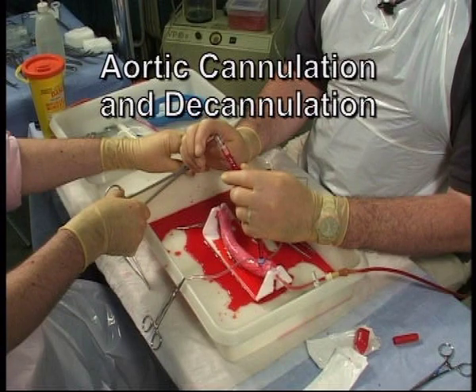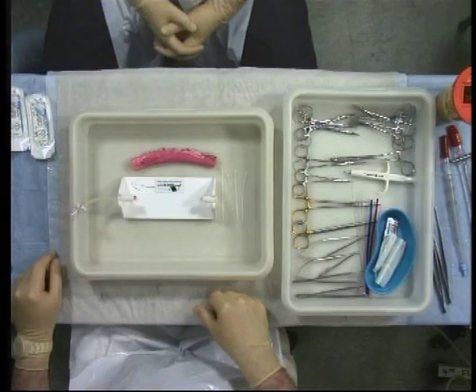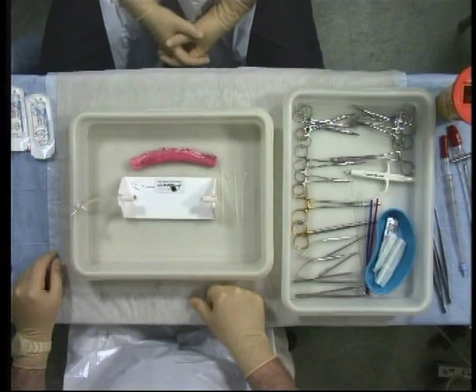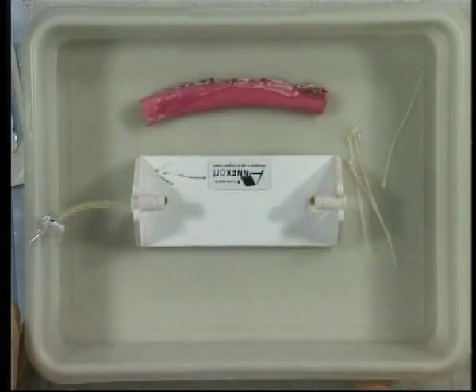Aortic cannulation and decannulation. The materials, instruments and sutures needed for this procedure are described in your workbook. In order to make the procedure as realistic as possible, we are going to be using a perfused pig's descending aorta and a simulated bypass circuit.